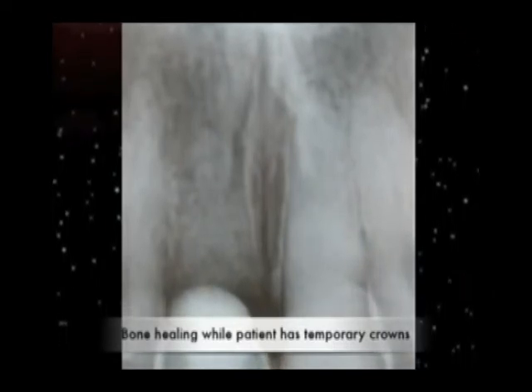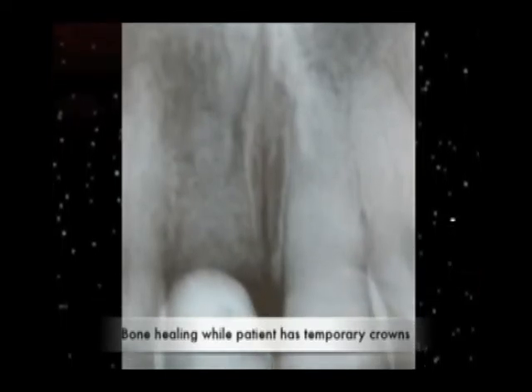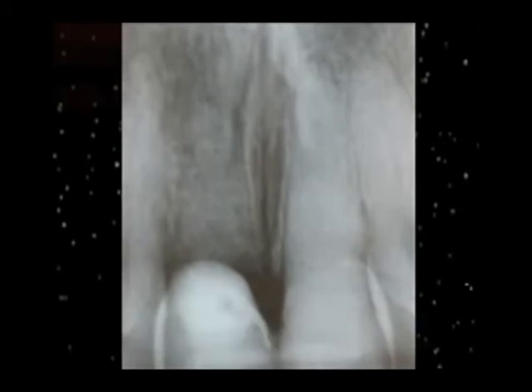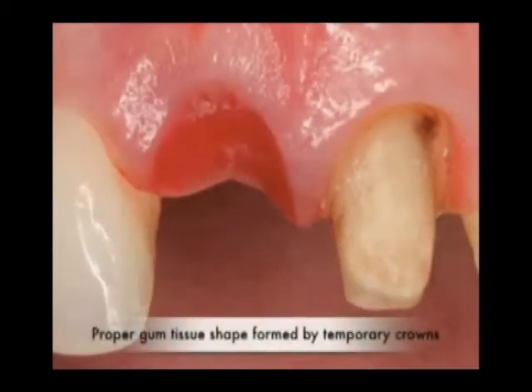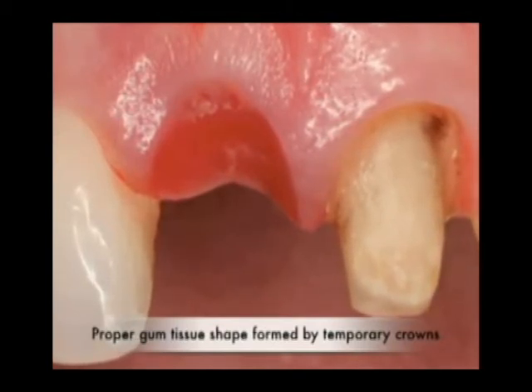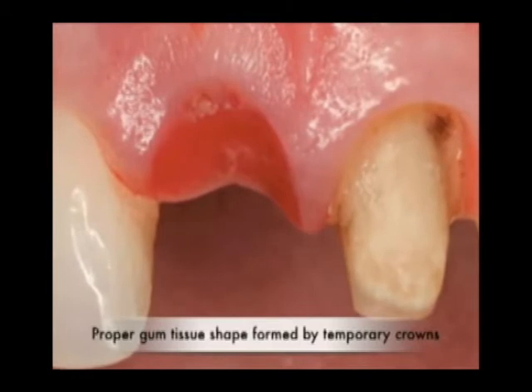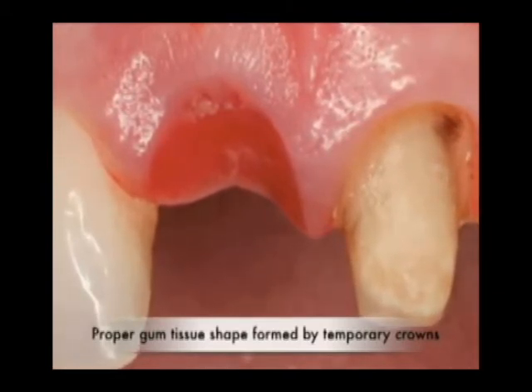We usually need several months of healing for the bone to mature and grow to your own bone to allow us to have a site for an implant placement. So after several months of healing, we come back and remove the provisional or temporary restoration that's been holding on one tooth and hanging off that one tooth into the missing tooth site.